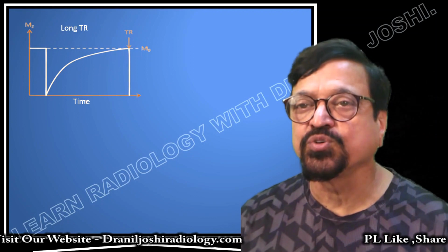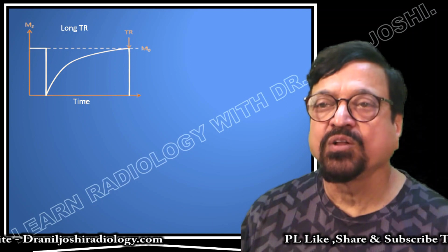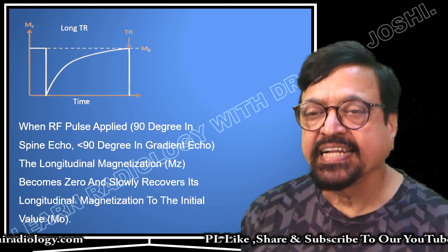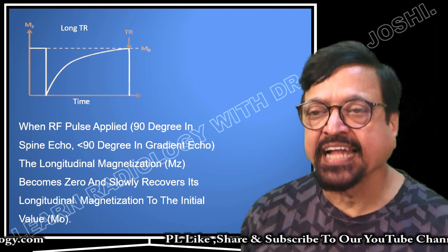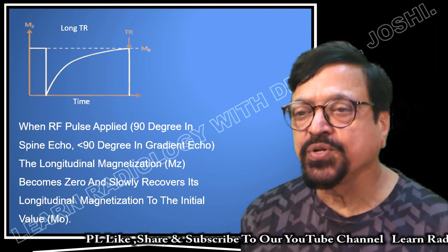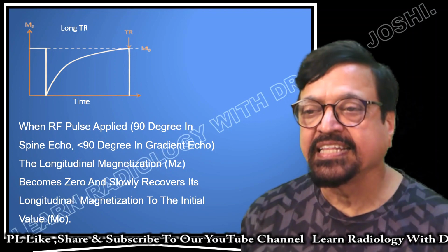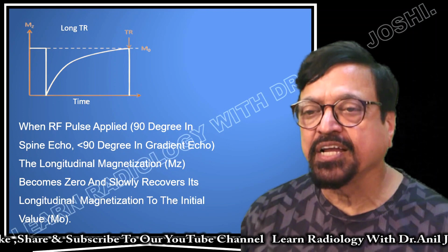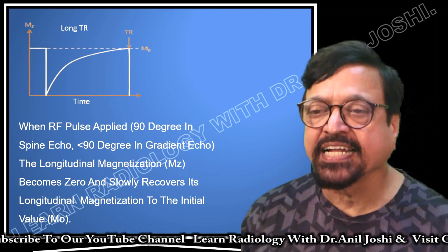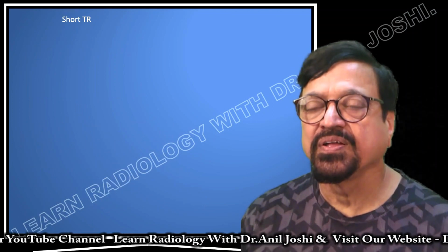Now, this is a graph which shows you magnetization. You can see a long TR over time. When an RF pulse is applied, 90 degrees in spin echo or less than 90 degrees in gradient echo, the longitudinal magnetization, represented here as MZ, that is magnetization along the Z axis, becomes 0 and slowly recovers to its initial value, that is M0.